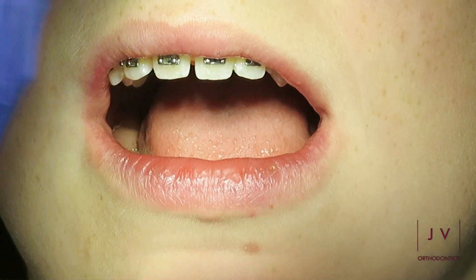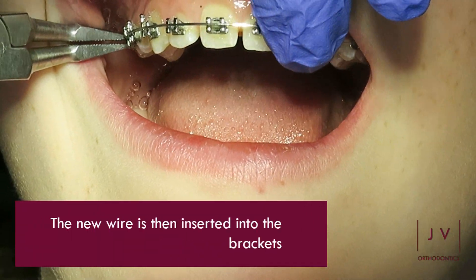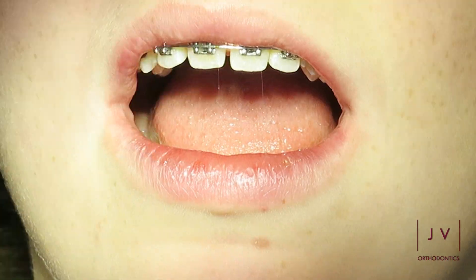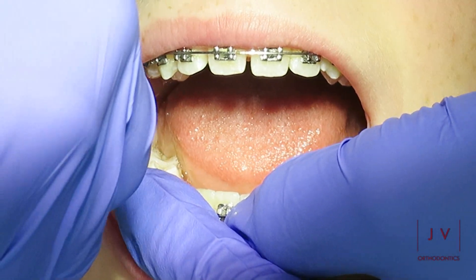Once we are happy with the new wire, we then carefully insert that back into the brackets of the brace. Sometimes you can feel the tightness of this wire as it's being inserted, because it's usually a thicker wire than the wire that was in previously, and because it's a thicker wire it fills the space of the bracket more than the previous wire.